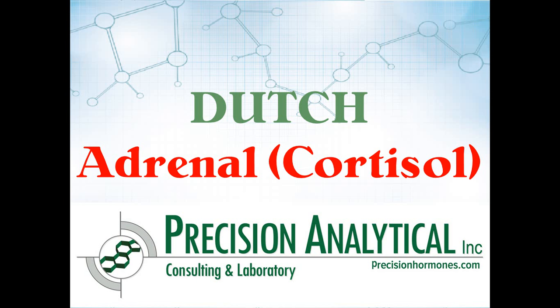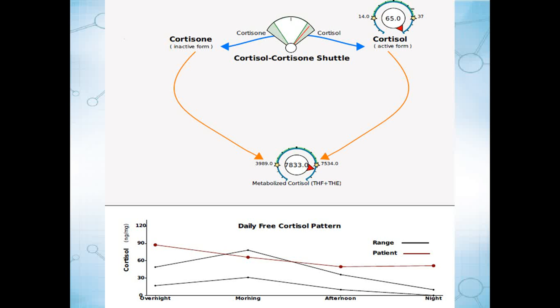This report tutorial is to assist you with the interpretation of the dried urine test for comprehensive hormones, the DUTCH test, specifically for the cortisol portion of the test. When we're looking at cortisol, typically it's easiest to start with the free cortisol pattern. This is usually the information that's gleaned from saliva testing, and that's one of the most unique features of this test, that we're able to look at the cortisol throughout the day in the free fractions.